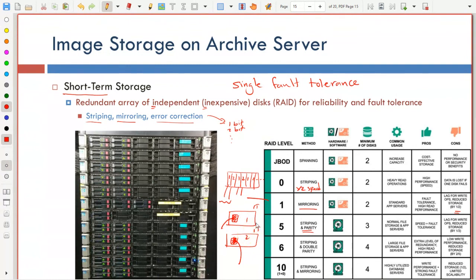For people who have a RAID storage, it looks something like this. I actually saw this myself, because I was working at a research center that was producing large volumes of MRI data every day, so we had to use something like this. Whenever a drive fails, the system detects its failure and tells you which one exactly failed. All you have to do is remove it and put another one. You don't have to do anything else. The RAID system, the operating system itself, repopulates it with the data from the other drives. So it's very nice to use.